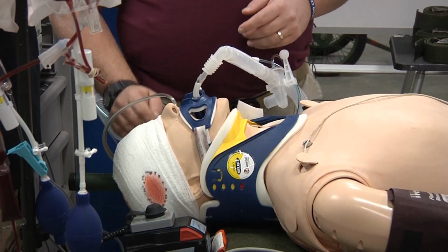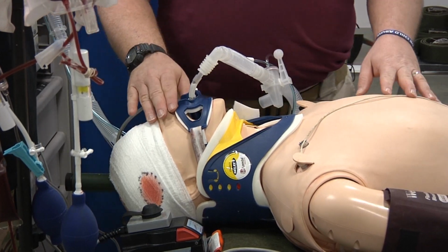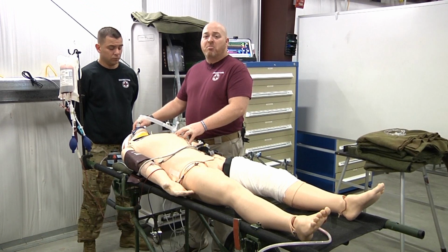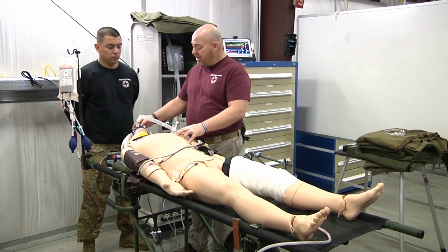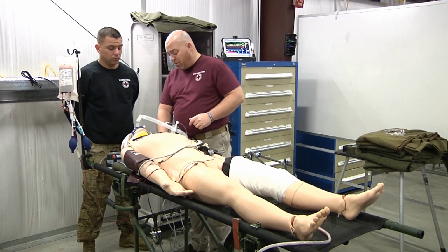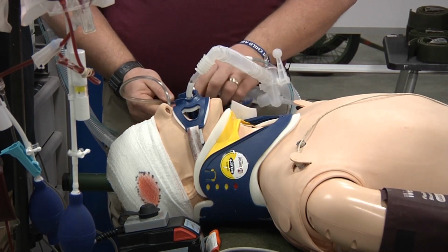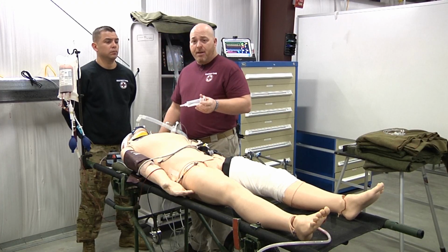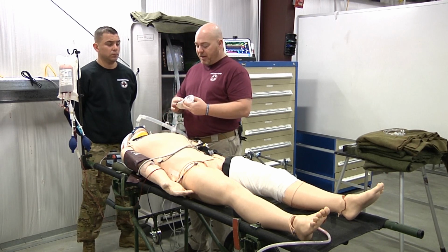All right. The next thing we can do is we're going to check and make sure that we have an NG-OG tube in place. It is recommended that all patients who are transported via rotary wing have an NG or OG tube in place. If not one in place, then we will place one. This patient does. So what we're going to do is we're going to ensure that it is open. And then another technique that we're going to do is we're going to grab some type of 60 cc or 50 cc syringe, Toomey syringe, something like that.